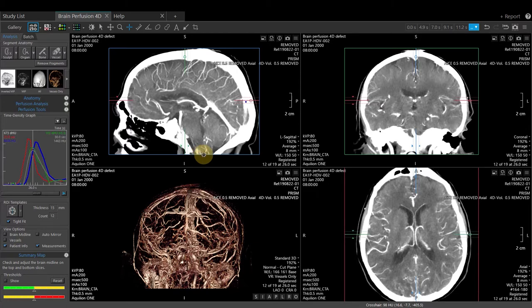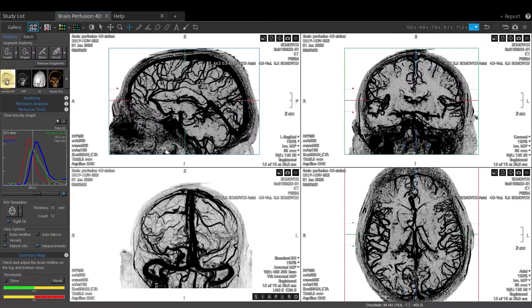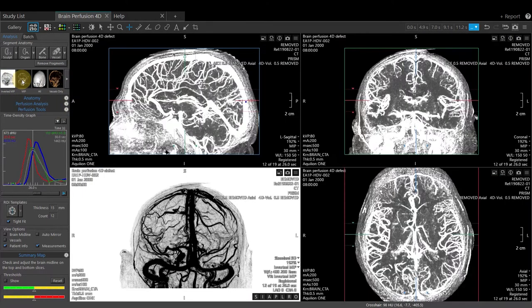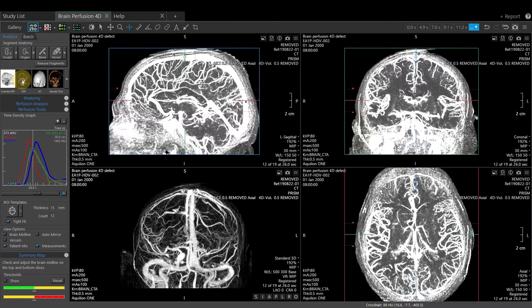Change our 3D preset to either inverted MIP or MIP in the 3D preset area.